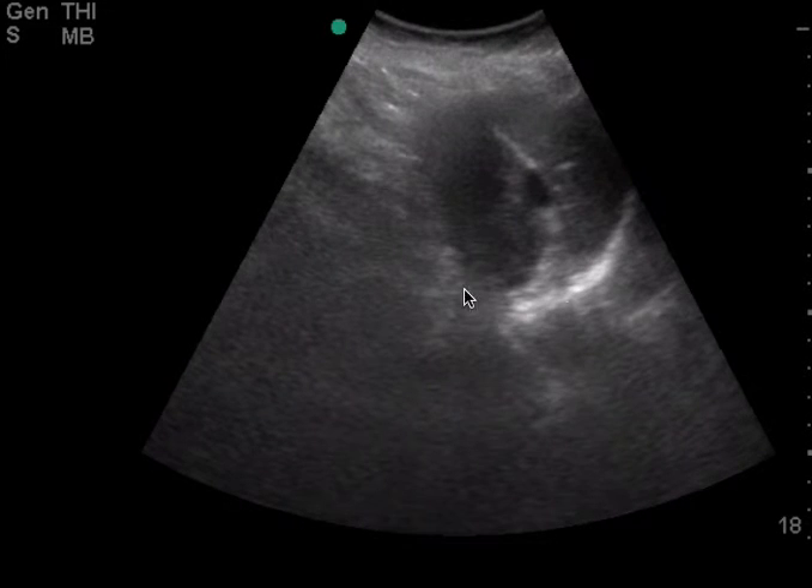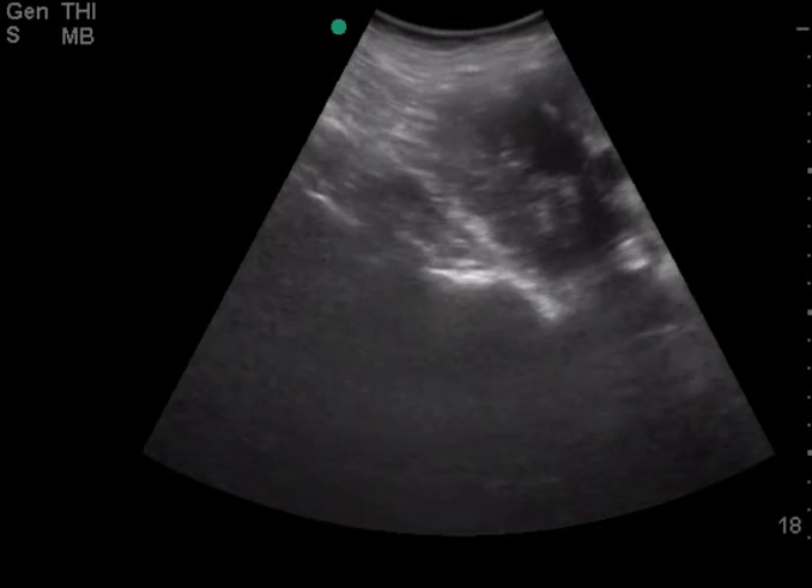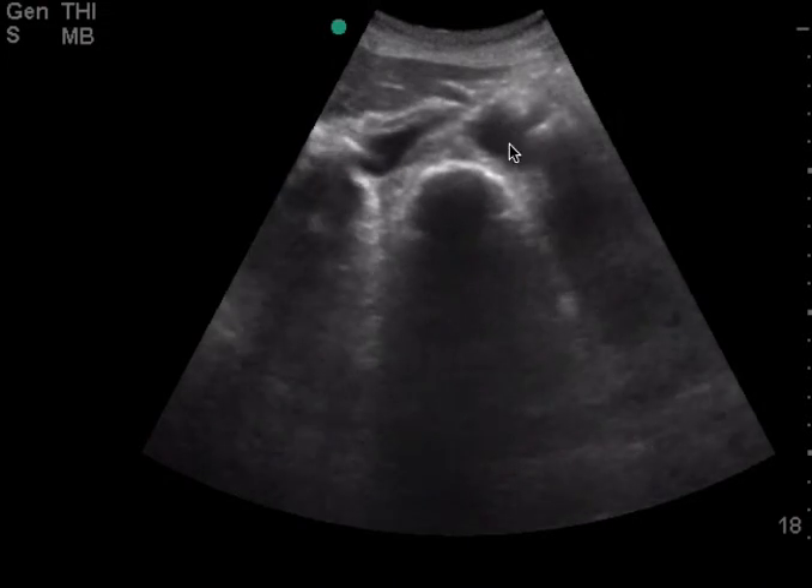In the left upper quadrant here, this is great. You can see the edge of the spleen here and you can see the kidney. It's a challenge, but you definitely got the view here. And then you move on to the aorta, which is awesome.